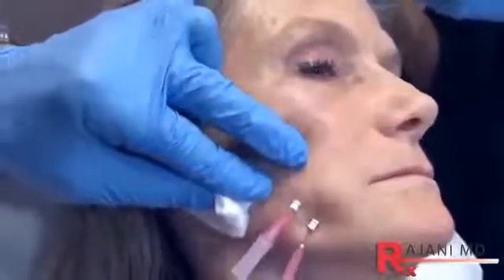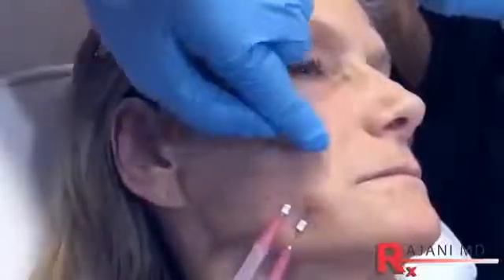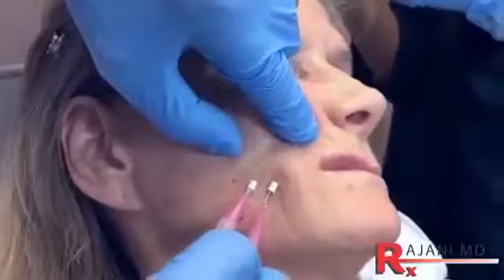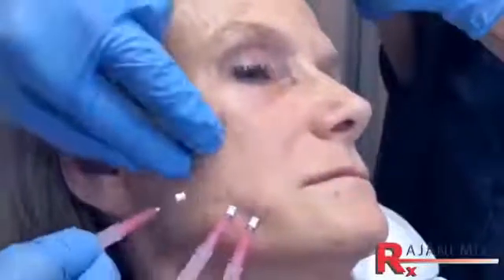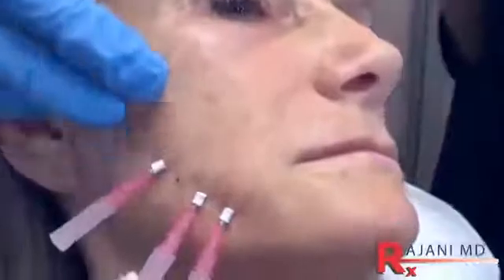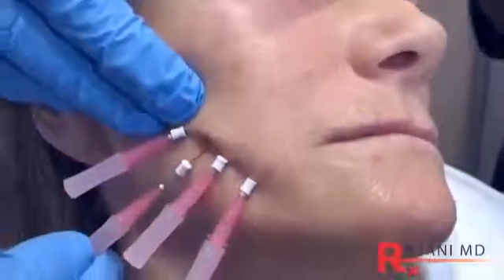And it's subdermal. Now I couldn't get the depth I wanted, so I'm going to tension the skin to create a straight pathway for me. And I always want to see a little bit of tracking of that thread coming through, and that assures me I'm at the right depth.